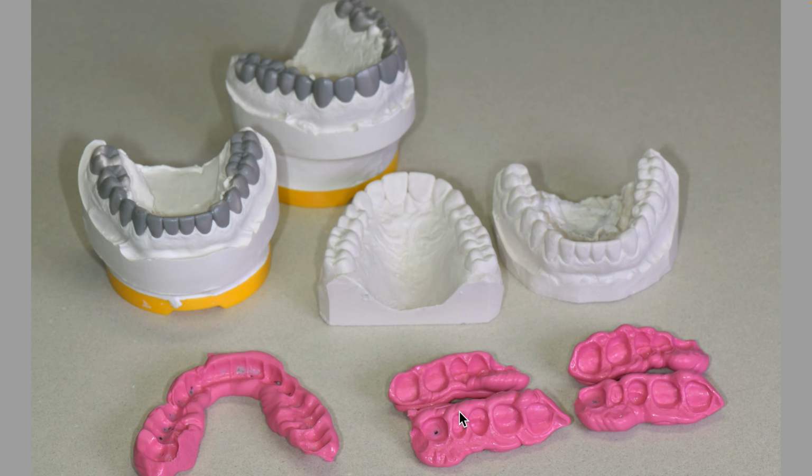And it has happened before where the patient's been going into different places and I didn't realize, mostly if I try to take the bites on the second prep day. Usually the patient's muscles are messed up from being open for 2 days and we don't get great bites. Here we did get really good bites, but I took them after the fact, after testing. So because of the big occlusal change, I didn't try to take the bites the prep day. You can also see the provisional to provisional bite where we verify how the contacts look after equilibrating the provisionals.